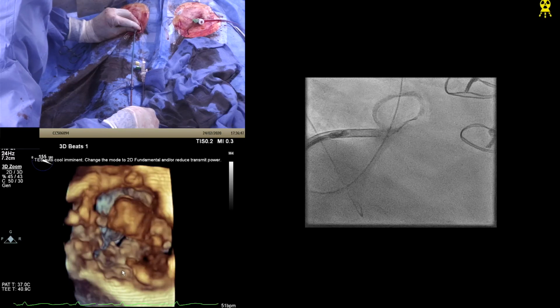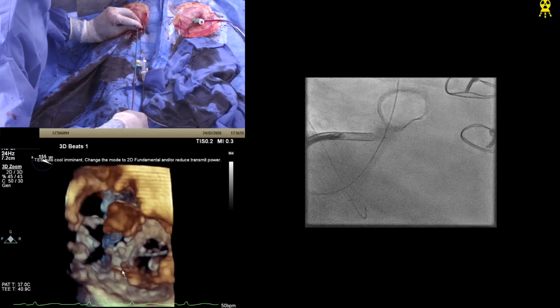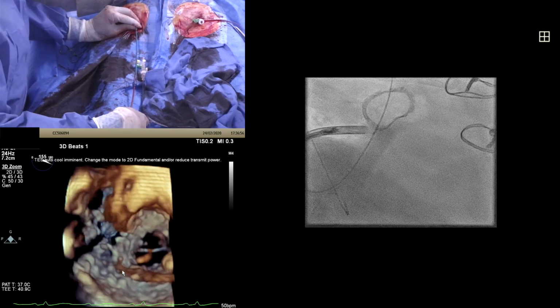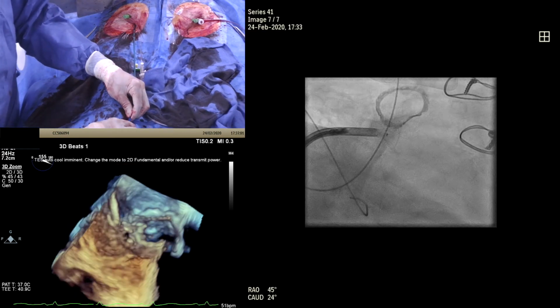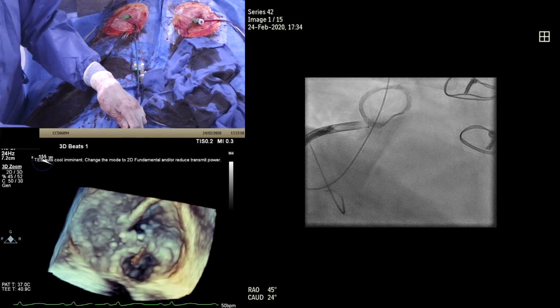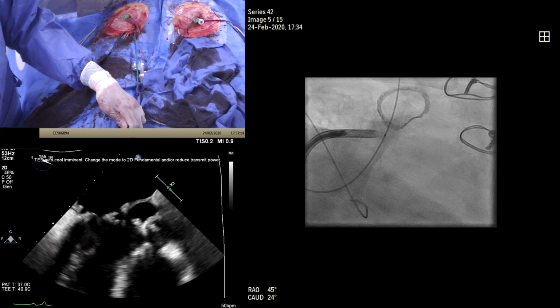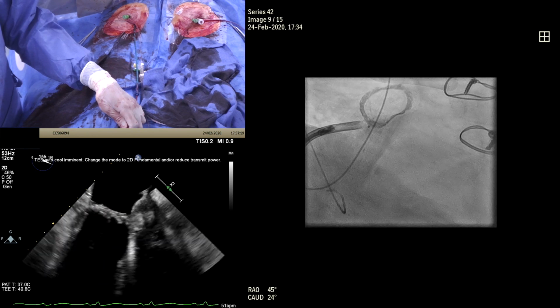I think you just take it back. I'm trying to rotate it more. The dots are more aligned than they were, so it has rotated, and you are along the line of the annulus here. I've got a lot of rotation on. I'm on the annulus, I think. Are you happy that I am on the annulus from the LV side? If you do 2D, you can see how we've caught the aortic and mitral.